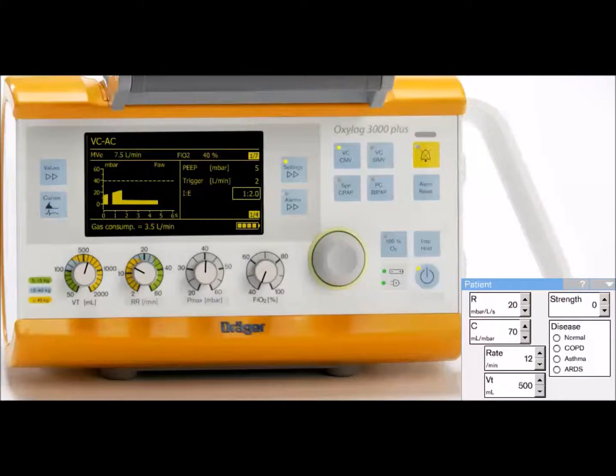So as you can see, there's not a separate mode. Here's all my modes. I'm going to move my cursor around, and I'm currently using volume control CMV, but there's not a mode tab that specifically says with a dual targeting scheme or Pmax. So with this setting, if we look down at these set points, I have tidal volume, respiratory rate, Pmax, and FiO2. So this Pmax actually turns my volume control CMV into that dual targeting scheme. So it's more of an augmentation to my volume targeting modes to make it a dual targeting scheme.